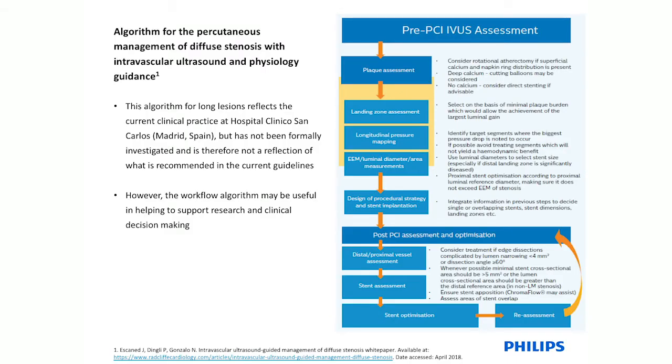Now, what we'd like to share with you is basically a structured approach to the diagnosis and IVUS-guided management of long stenosis of diffuse disease, which also takes into account the information that you can obtain with intracoronary physiology. And what we would like to share is this algorithm that has been developed at our institution, at Hospital Clínico San Carlos, that reflects our practice.